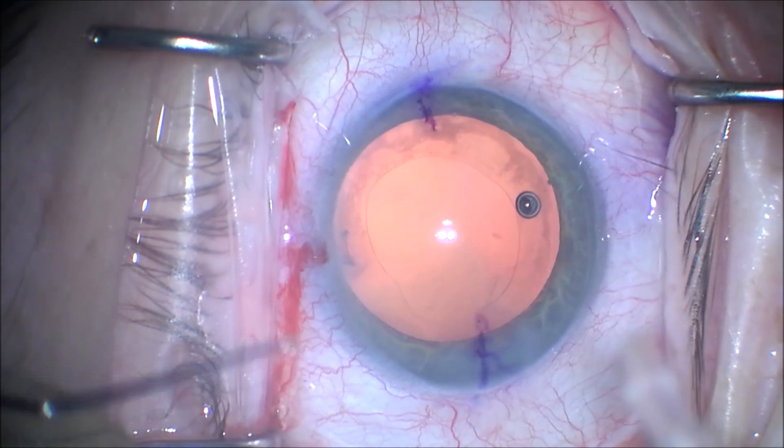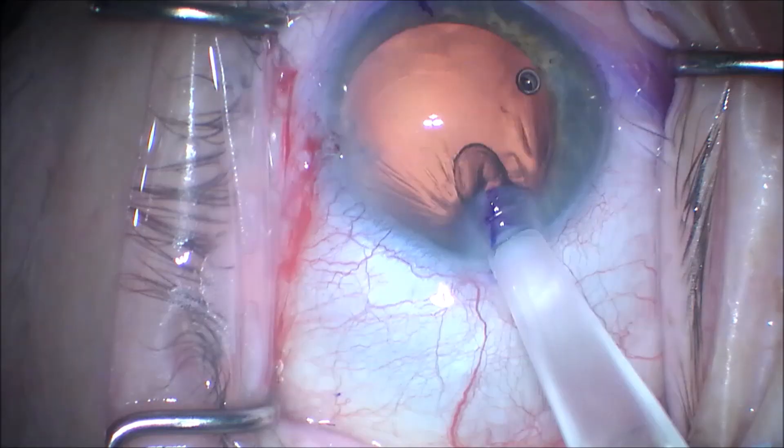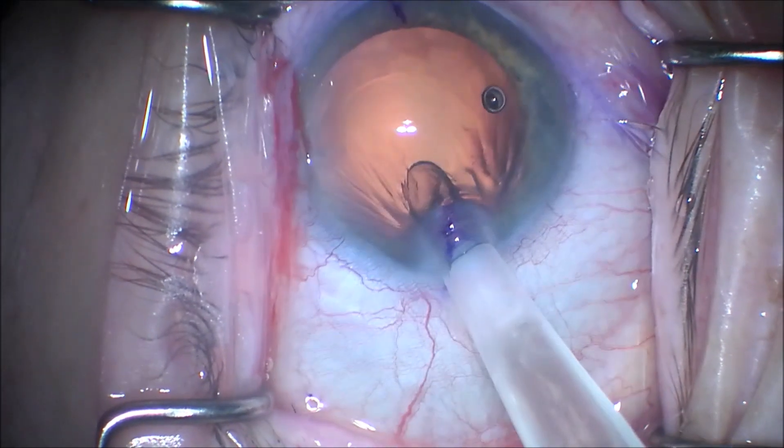As we place the intraocular lens implant, we use a Sinski hook to stabilize the eye as we inject in the intraocular lens implant.